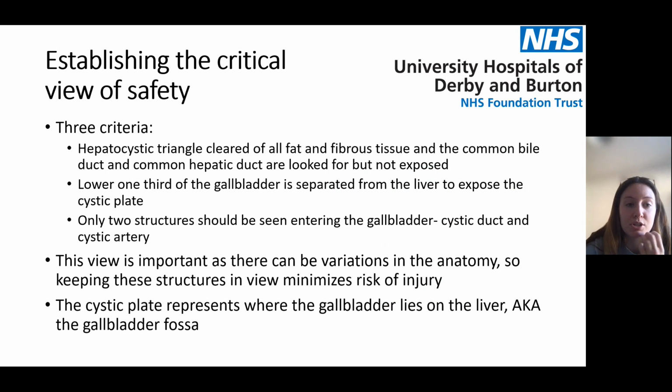So next is establishing the critical view of safety. So there are 3 criteria for this. This is a really important view of safety, and it's because there are variations in the anatomy from person to person. So keeping these structures in view minimises the risk of injury.